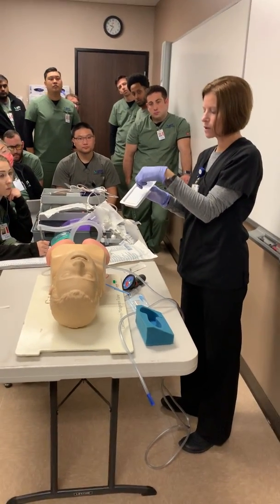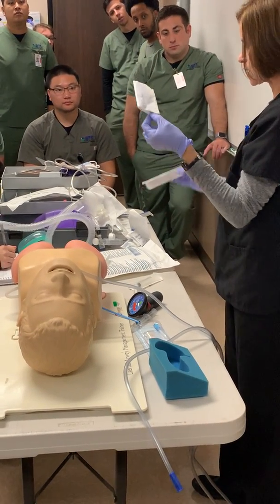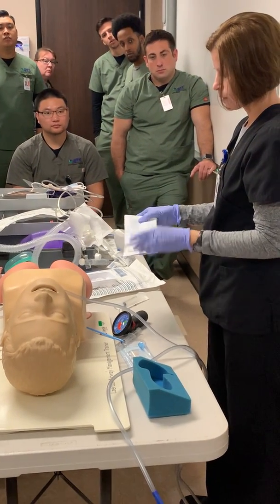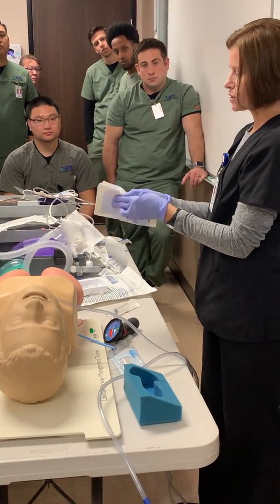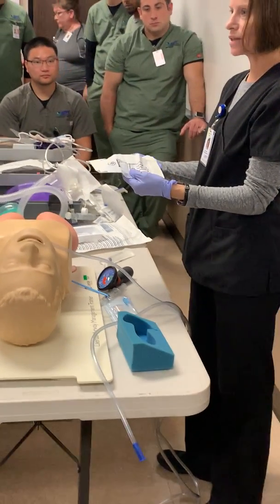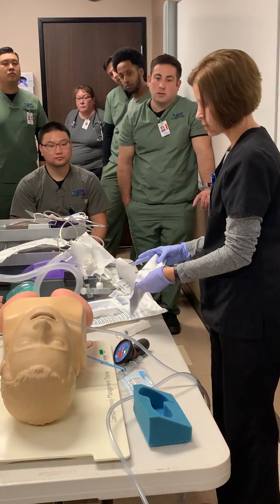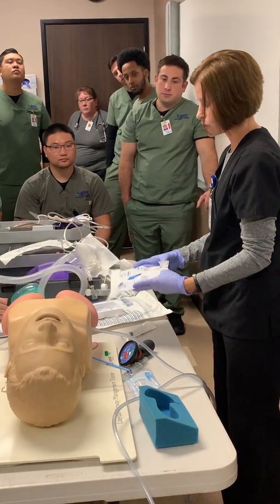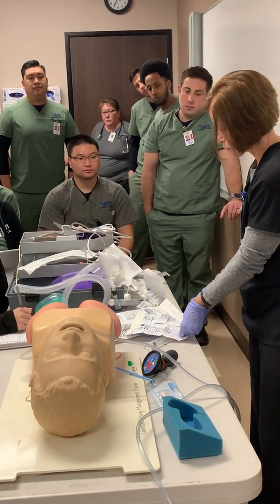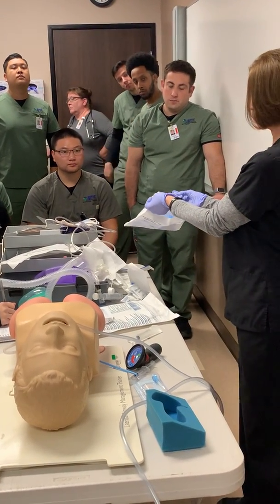When I lift this out, I want to make sure that I don't touch the catheter that's underneath it. So I'm taking out my gloves. I'm going to put this down. I'm going to open them up. Now the sterile part is inside, right? Everybody sees those little blue gloves, so that's the part that I don't want to touch. So I'm going to fold back the ends, and a lot of times I'll have the patient tray table next to me for a spot. I'm going to grab these corners. Can everybody see these corners right here?